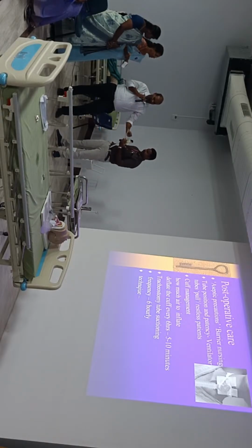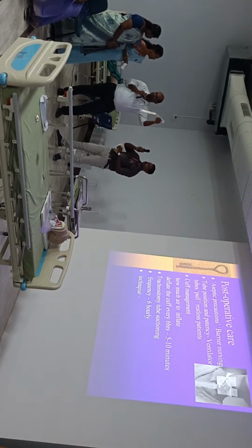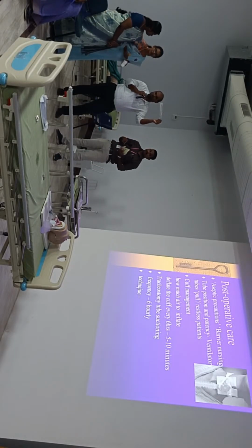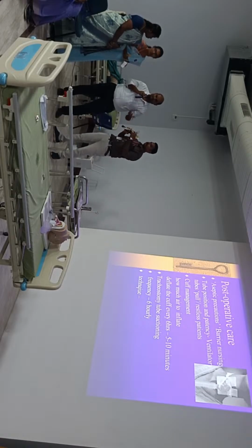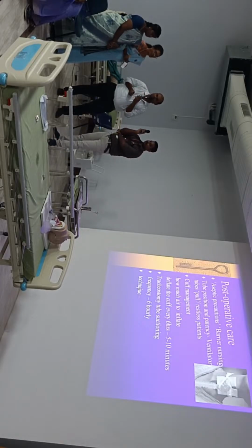But in our hospital we use a Foley's catheter. This is a Foley's catheter. This is an atraumatic one. So how much do you insert it in, in awake patients and patients who are on ventilator? Now you have chosen the material. This is atraumatic. Now how much do you insert it in? It's a blind procedure, right? So how do I know I have reached the trachea?